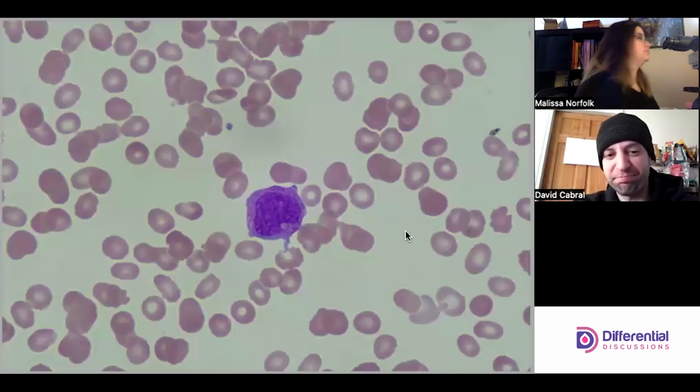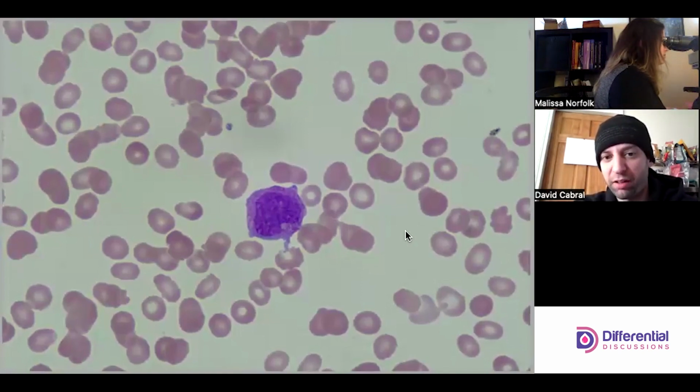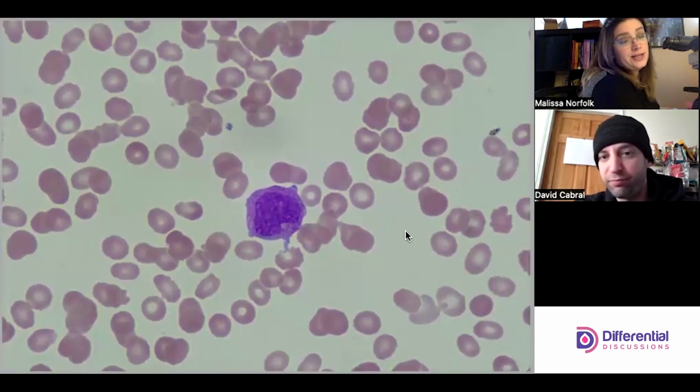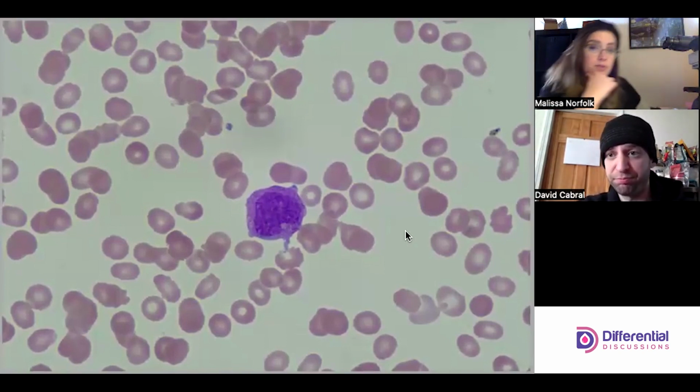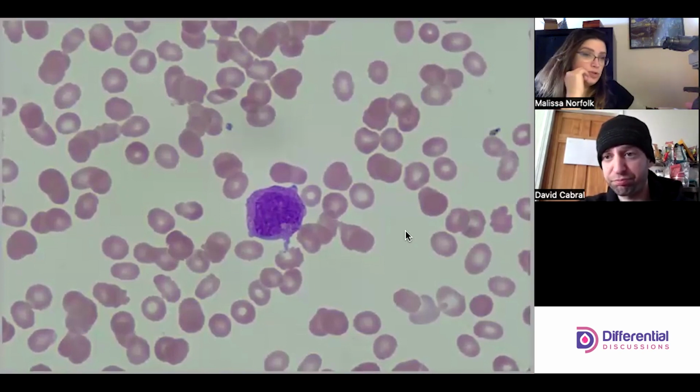So just a little background, I guess. And there's no classic butterfly here, it's just an indent. For the most part, besides the nucleoli, the shape's a little funky too, right? But besides the nucleoli, overall, the nucleus looks pretty darn normal as far as an APL is concerned. If you think about the shape too, it has almost more of that horseshoe monocytic shape to the nucleus.